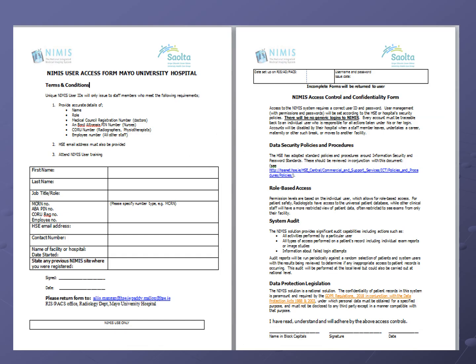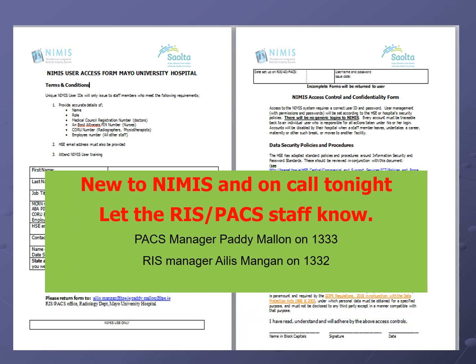When you have completed this presentation, please come to the PACS office for your login details. You must bring these access control forms with you, filled and signed. They can be obtained from the Medical Manpower office or the PACS office. Let the PACS staff know if you are on call tonight. We will get you to log in and ensure that you have access.